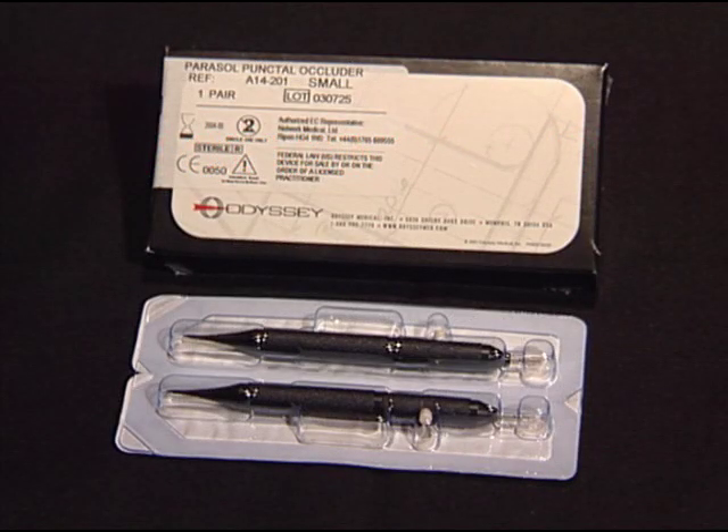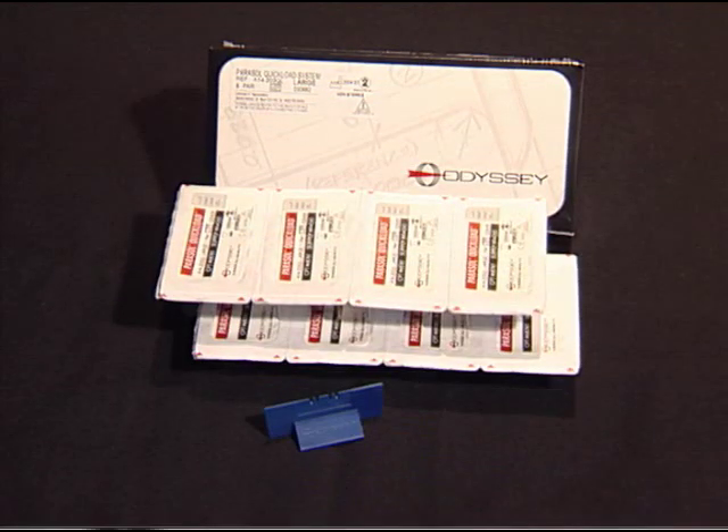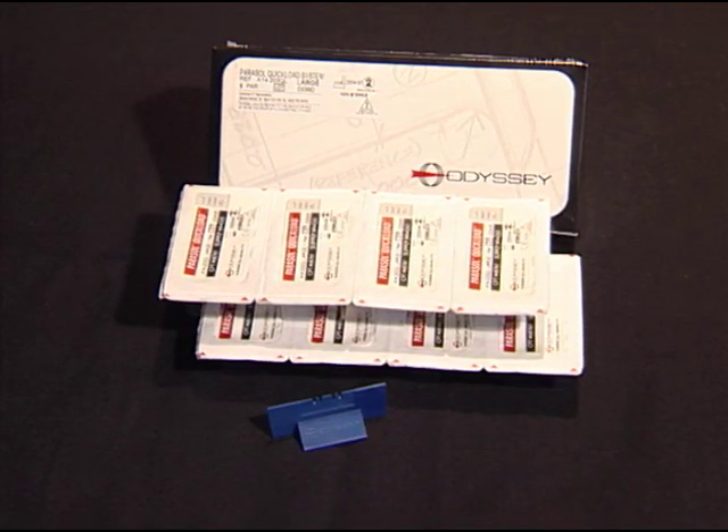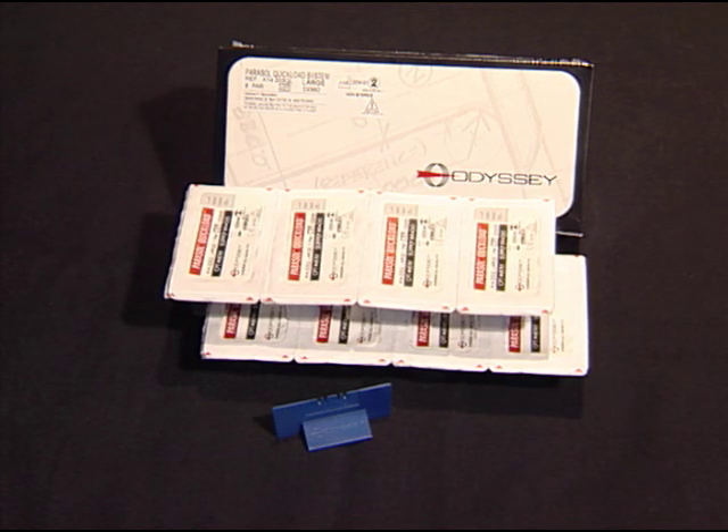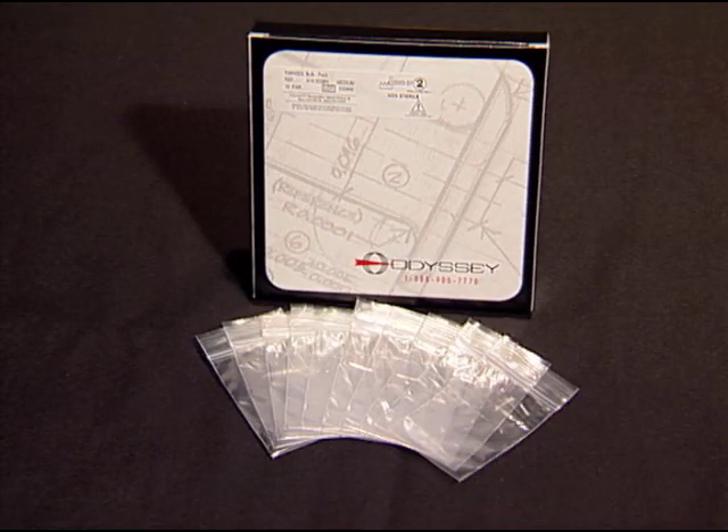Pre-loaded sterile occluders are sold in pairs already loaded on insertion instruments. Sterile quick load occluders come in eight pairs per box mounted on a special plug stand for quick loading. Or, for the greatest savings, the non-sterile bulk pack contains ten poly-bagged pairs per box.